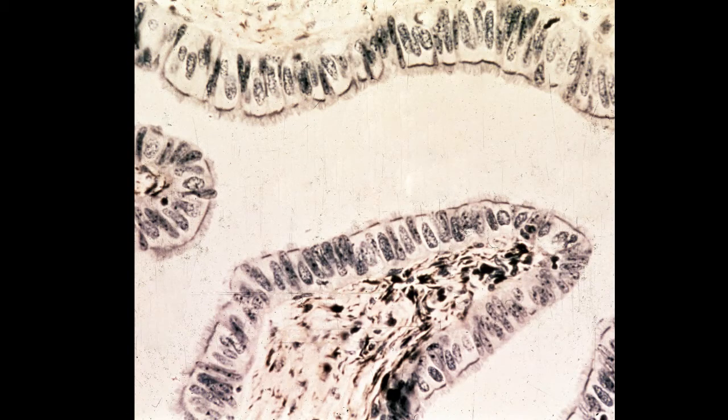This is a profile through the oviduct. It's a ciliated simple columnar epithelium, and here you can see profiles of the cilia. We'll have more to say about the oviduct later in the course as well. How do cilia differ from microvilli? That's one of these questions I'll leave for you to try to discover on your own.